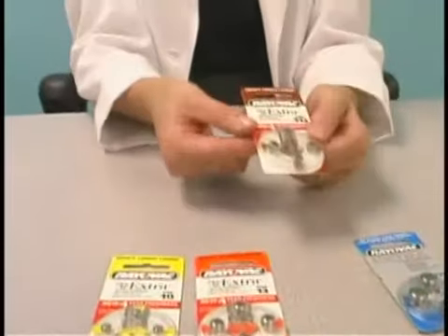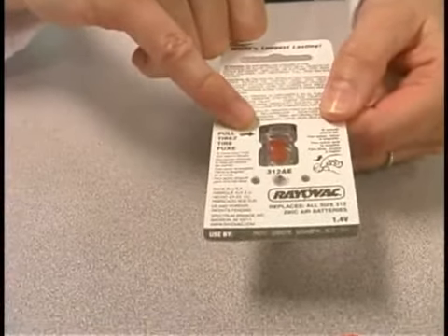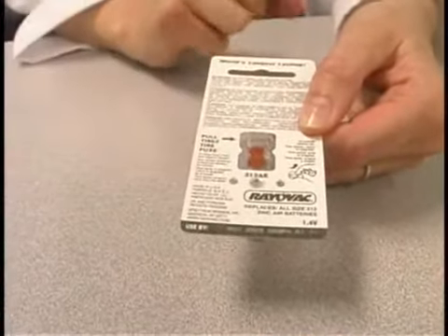Hearing aid batteries are zinc air batteries, so they're activated by air. If you look at this package of batteries, turn it over, you'll see there's a tab. As soon as you remove that tab from the battery, the battery has been activated.